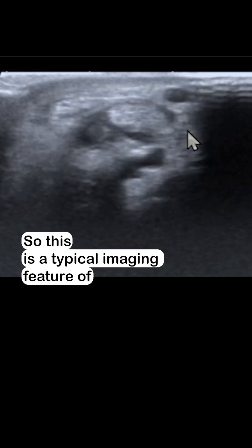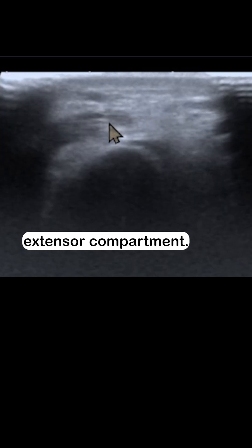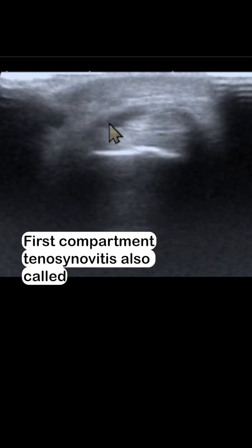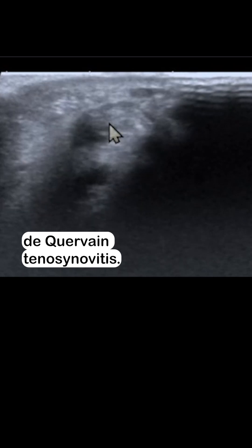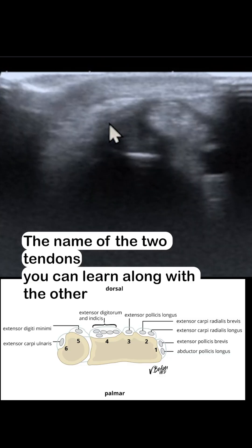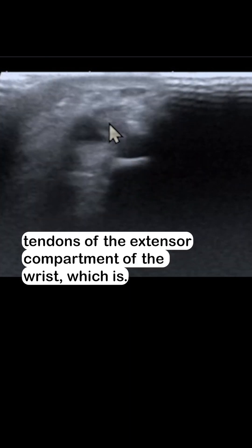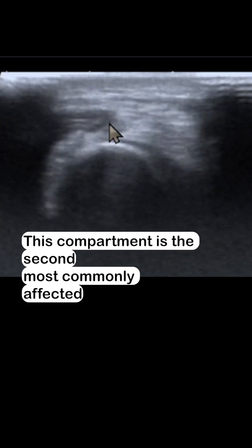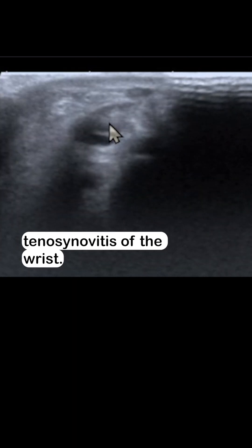This is a typical imaging feature of first extensor compartment tenosynovitis, also called De Quervain's tenosynovitis. The names of the two tendons can be learned alongside the other tendons of the extensor compartments of the wrist. This compartment is the second most commonly affected in tenosynovitis of the wrist.